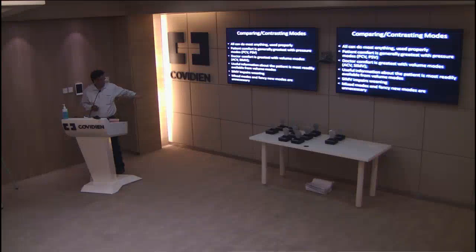Okay. And like I told you, SIMV, though very popular, probably should not necessarily be used, and probably actually prolongs the entire weaning process. So probably not a big role for SIMV nowadays, though still extremely popular, but probably not really very useful. And by and large, each time you keep getting newer ventilators, a lot of fancy modes, more expensive. But as you grow older and wiser, you realize you really don't need them.